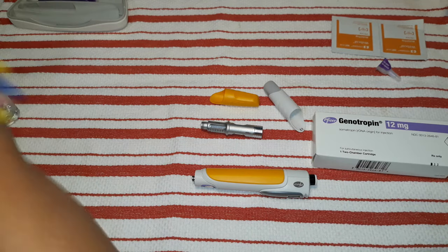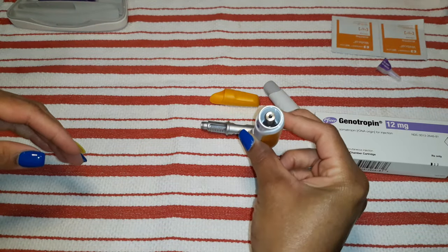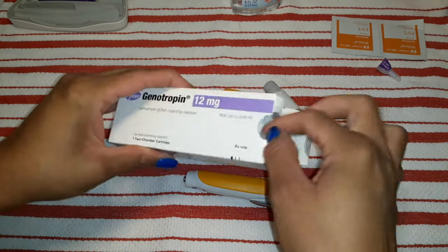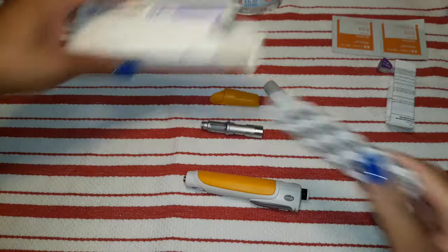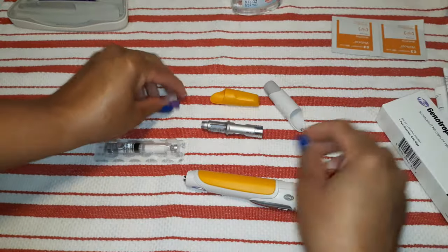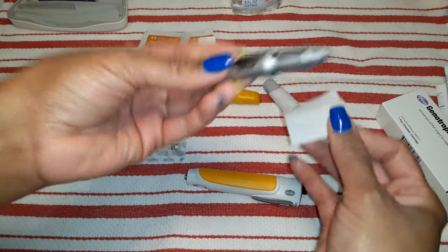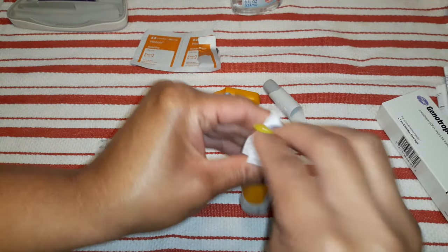What I'm going to do right now is replace her Genotropin. As you can see, the old one is out of there. I just finished sanitizing my hands. I'm going to open the box here. This is what it looks like. I'm going to take alcohol wipes and wipe this part off. This contraption actually goes on top of that, so I'm going to wipe this down because you want this stuff to be nice and sanitized.